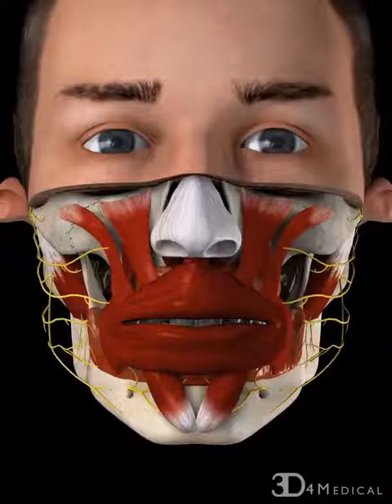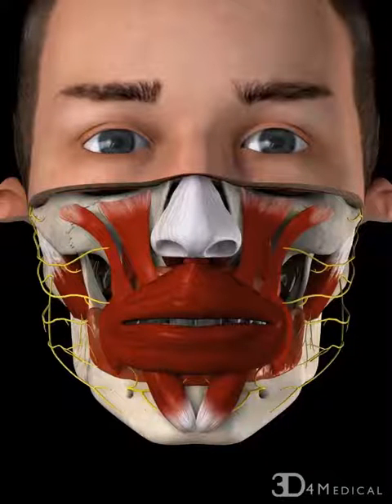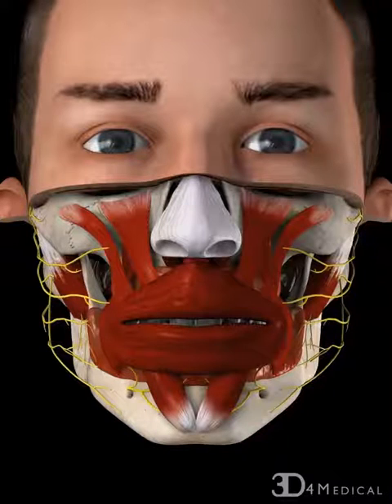A dental implant is used to replace a missing tooth. When a crown is fitted on top of the implant, it gives the appearance of a natural tooth.